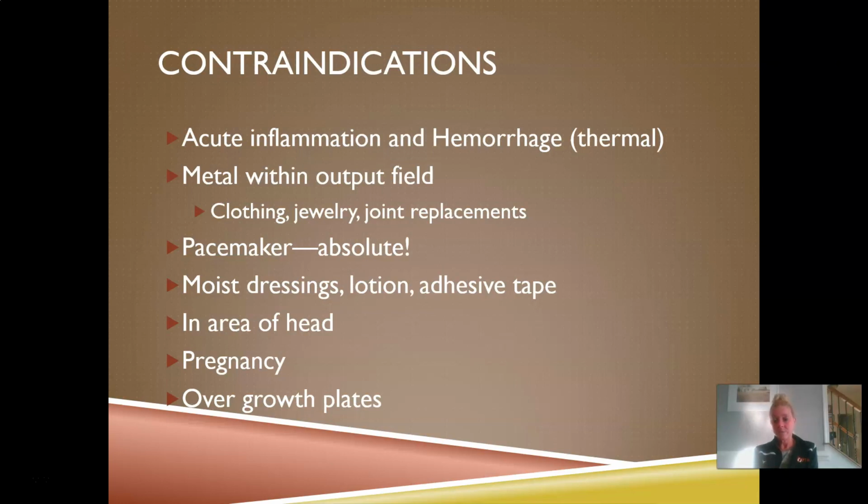And then this one deserves mentioning too, growth plates. This one wasn't on your ultrasound contraindication list, but when I was in school in my textbooks, it was mentioned for ultrasound as well. And because these modalities are so similar, you do absolutely want to use caution over growth plates. So growth plates, again, present until we're done growing, 18 to 25-ish, they say now.